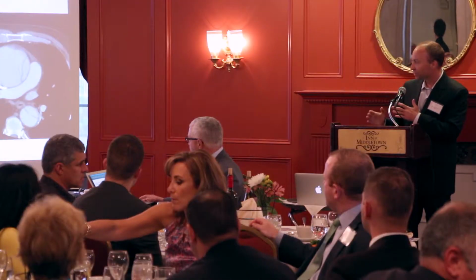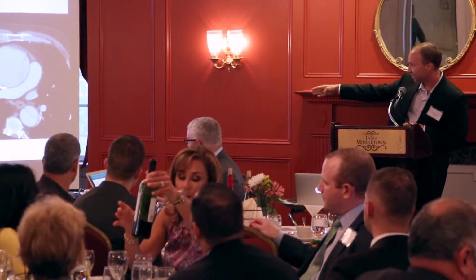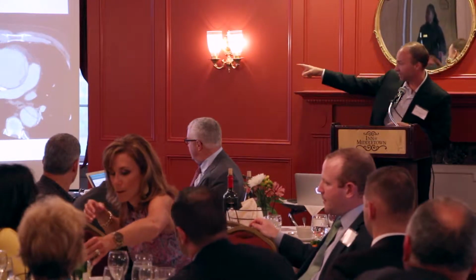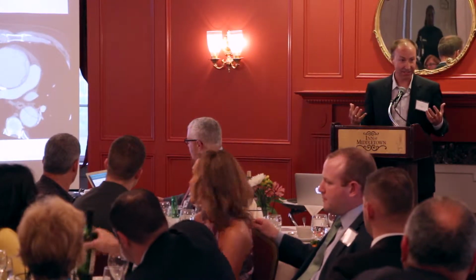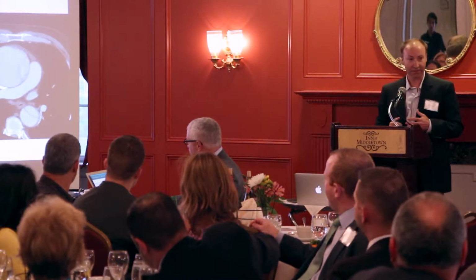And the tear generally occurs about 2/3 of the way through the wall. And you can see over here on this CAT scan, this is a dynamic CAT scan which is showing the movement of the aorta and the tear. And you can see the little line in the aorta, both in the upper aorta, which is the ascending aorta, and the descending aorta, which is down in the lower right. You can see that tear, and it's very dynamic. It's moving back and forth.